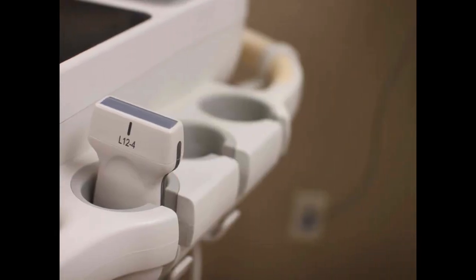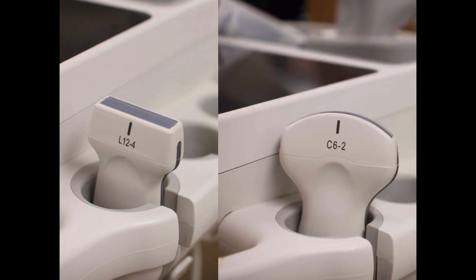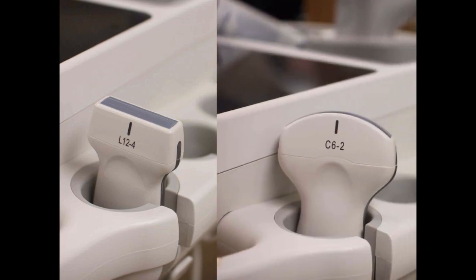First, we're going to talk about which probe you should use for this examination. Your go-to probe should be the linear probe. This probe is great for superficial structures and will give you really good resolution of the pleural line. In a pinch, or if you're at the end of an EFAS exam, the curvilinear probe will definitely work.